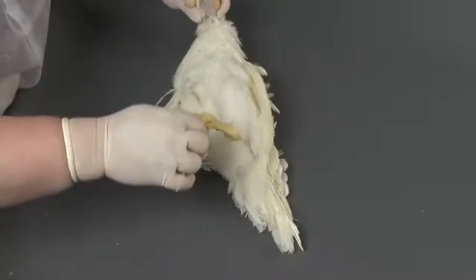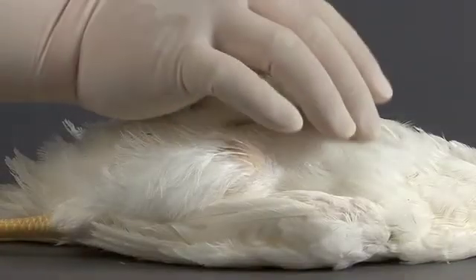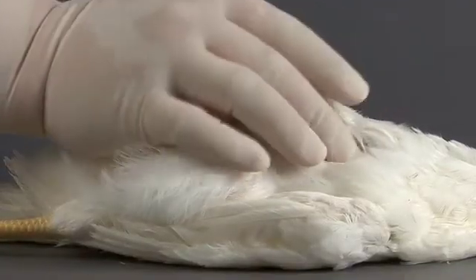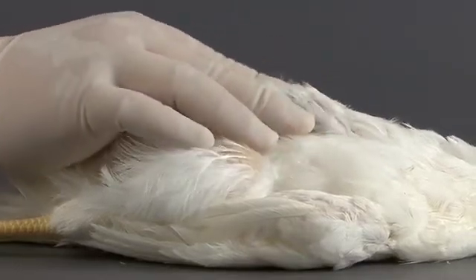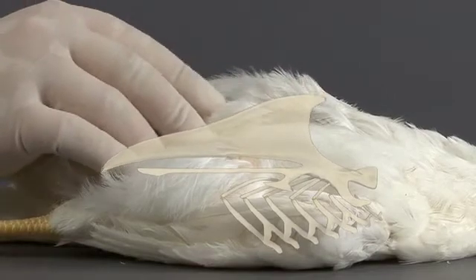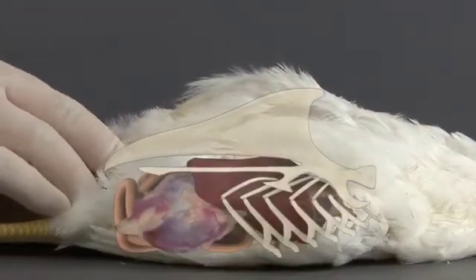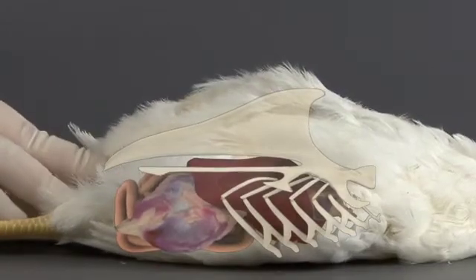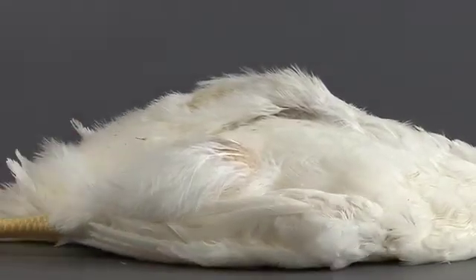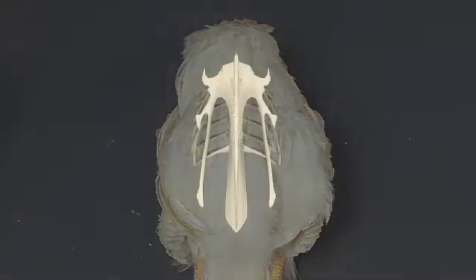Place the bird in dorsal recumbency. Lightly palpate the area over the coelomic cavity, assessing the subcutaneous tissue for crepitus. Using greater pressure, palpate the keel and ribs for fractures. Finally, palpate the deeper structures in the underlying coelomic cavity, feeling for any swelling or effusion. The keel bone should also be evaluated for any deviations, which may be caused by nutritional imbalances.